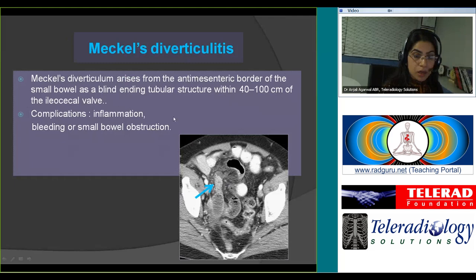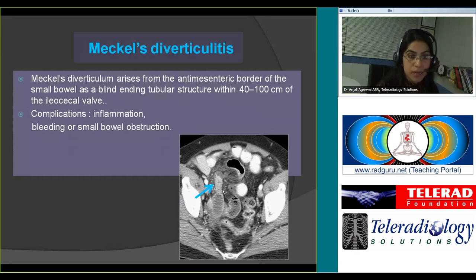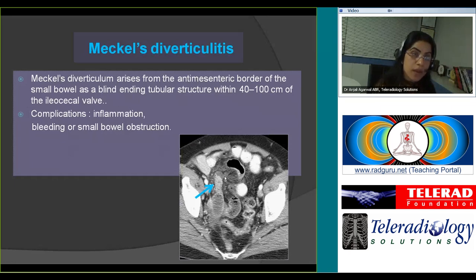Meckel's diverticulum can also get inflamed. It arises from the antimesenteric border of the small bowel and is seen as a blind-ending tubular structure, usually within 100 centimeters of the ileocecal valve. Apart from getting inflamed, it can result in bleeding due to ectopic gastric mucosa or cause small bowel obstruction. Before diagnosing Meckel's diverticulitis, identify the normal appendix and trace the distal ileum.